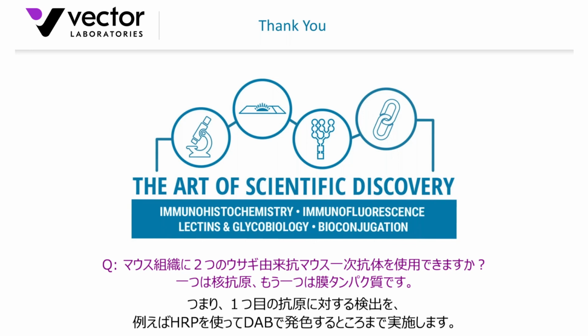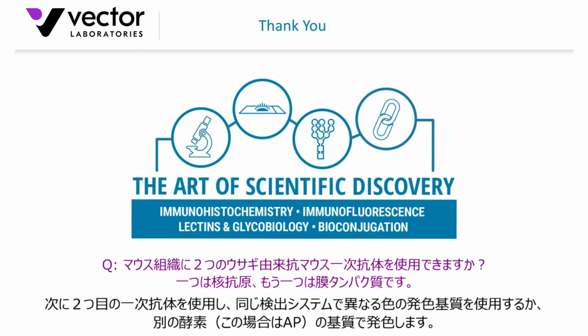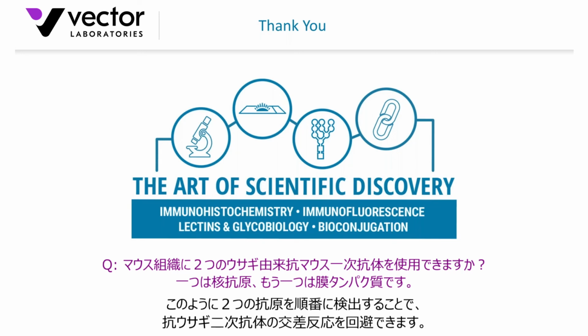So you would detect the first primary antibody, the first rabbit, with a given detection system. It could be peroxidase, and you develop with DAB. Then you would apply the second primary antibody and run that through with the same enzyme-based detection system and use a different colored substrate. Or you would use a different enzyme-based system and develop with a different alkaline phosphatase-based substrate. So that would have to be run sequentially to avoid potential cross-reactivity.